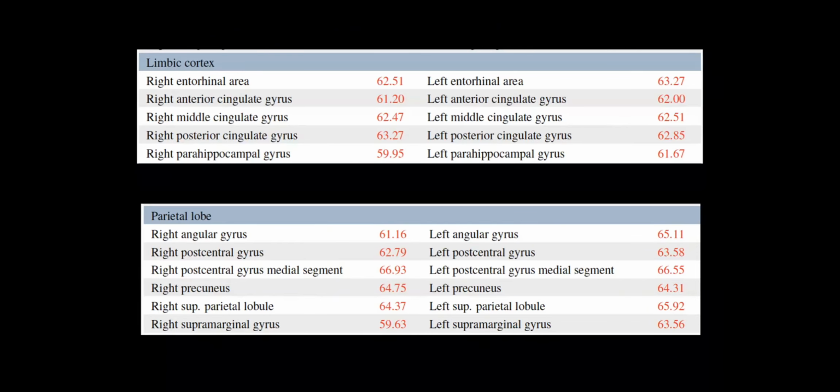However, Alzheimer's doesn't start until age 65 on average, and this individual is 54. So what's happening to the entorhinal cortex? Well, it has an abnormal brain age of 63 years and such on the left and about 62 years on the right. So upwards of almost a decade older than this individual's chronological age of 54. But that's not all. We can see that the posterior cingulate gyrus, another area that is affected by Alzheimer's disease, is upwards of close to a decade older than this individual's chronological age. The parahippocampal gyrus, again, 5 to 7 years older than the chronological age.